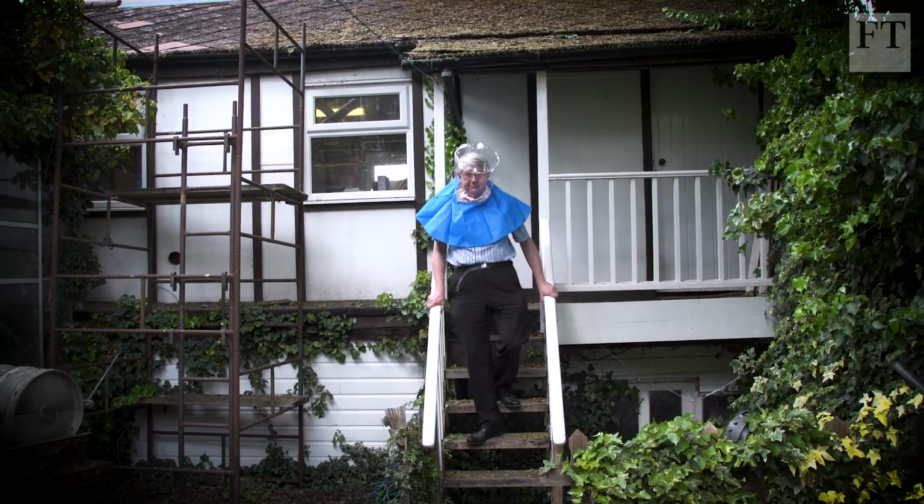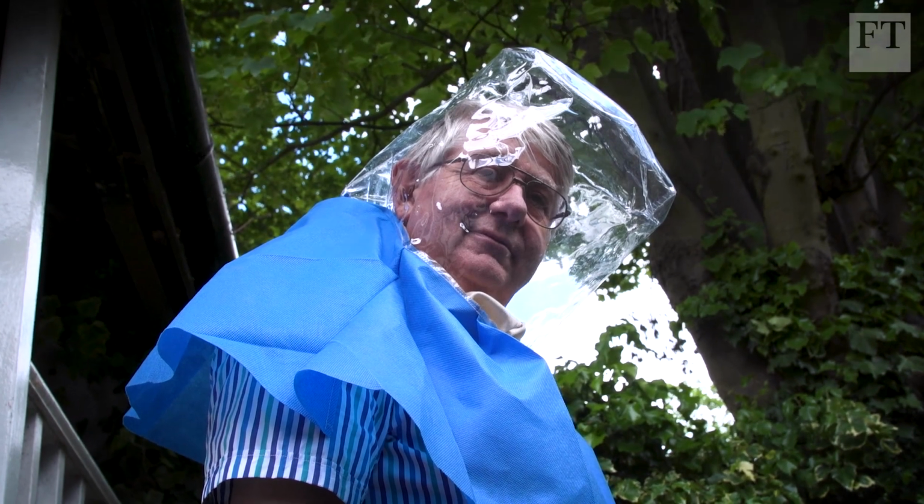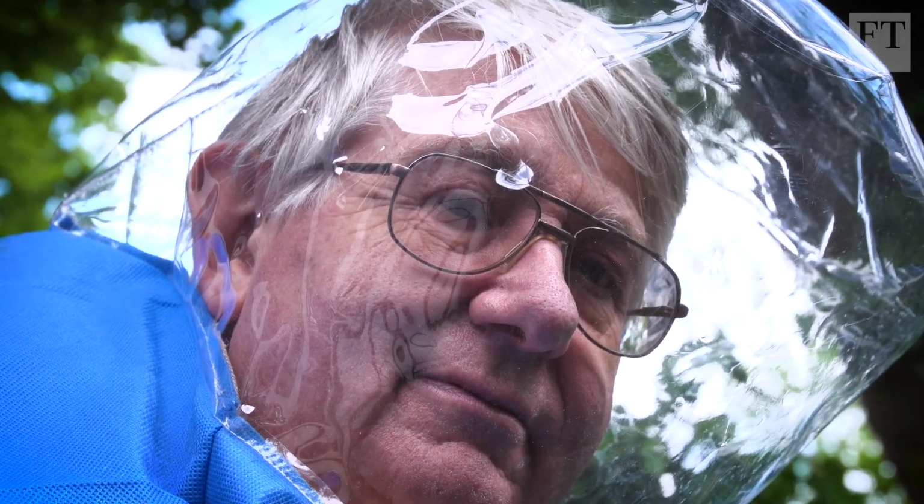This is Professor Mike Bradley with his latest invention. A pump feeds filtered air into a hood, protecting the wearer from Covid-19. Mike thinks it could be a lifesaver for doctors on the front line and help workers at risk, like carers and bus drivers. But how does a man with an idea make that idea a reality?